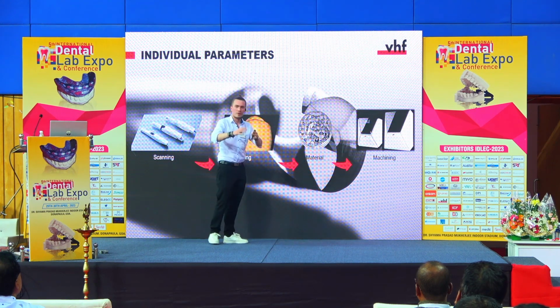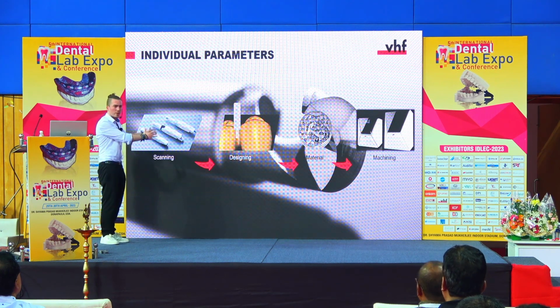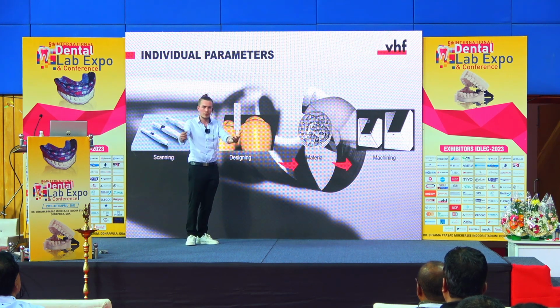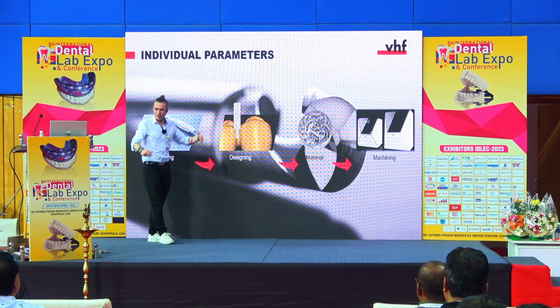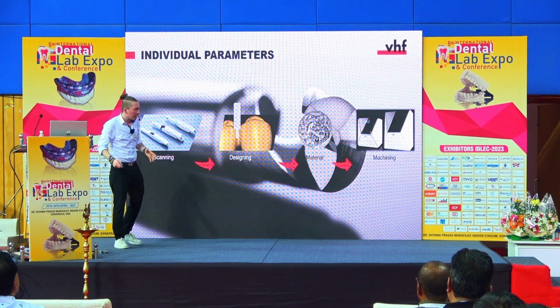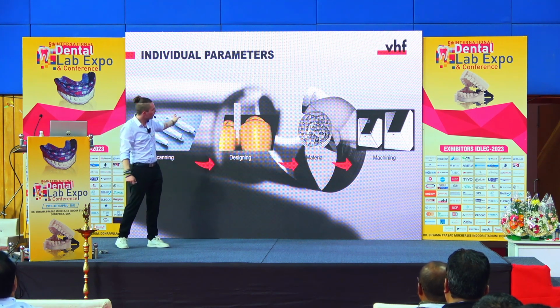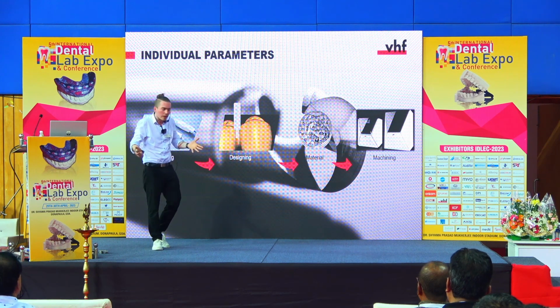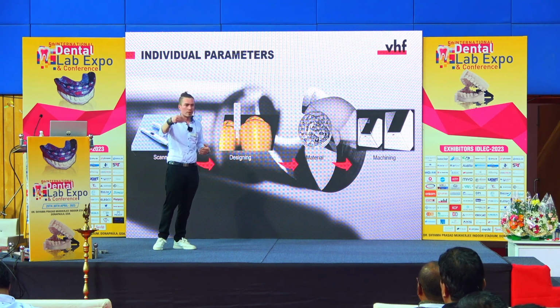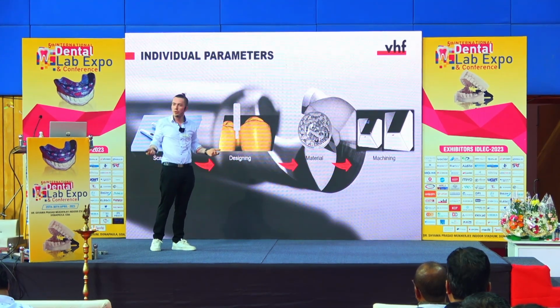And now, when it comes to milling implant prosthetics, this is also the complete workflow, but this is in your hands. So we're an open system. We cannot tell you what kind of material you use. It's your choice. We cannot look at the design you make. It's your choice. And of course, we don't know what kind of scanning device you use, because this is also your choice. And when you have a small offset already at the beginning, and then you transfer this offset to the design, and then you use some kind of material with its own characteristics, then you will create an error that is growing from each step, and then you will end up with an individual offset to the machine.